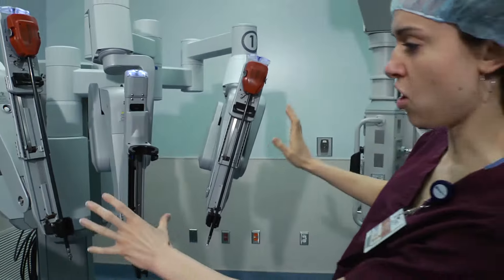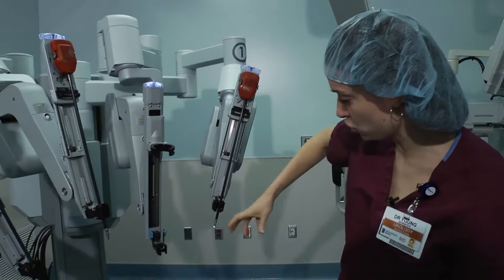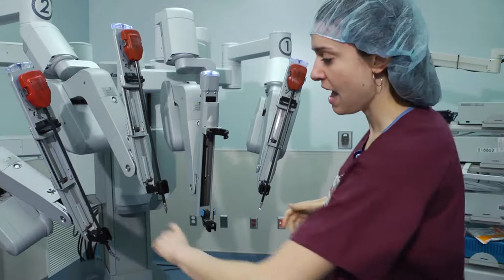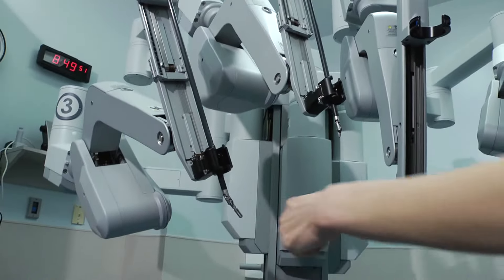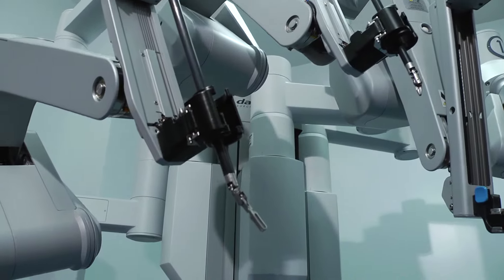This arm is controlled at a console in the corner by the surgeon's right hand, and this arm by the surgeon's left hand. You can actually click a clutch button and switch back and forth between these two arms with your left hand. Typically, with one hand we pull something aside or hold something out of the way, and with the other hand we actually do work.